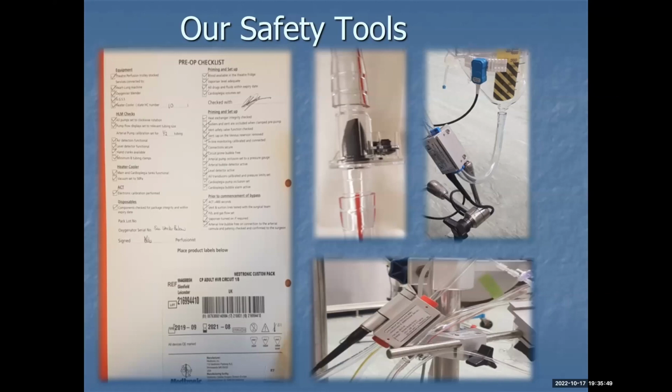So when we thought it was sucking, it was actually blowing. It's going to pump air into the patient. Now, this is a catastrophic event. This will kill the patient, and it has killed patients in the past. So we have these things that have one-way valves. And as part of the checklist, the rotation of the pumps will be checked.